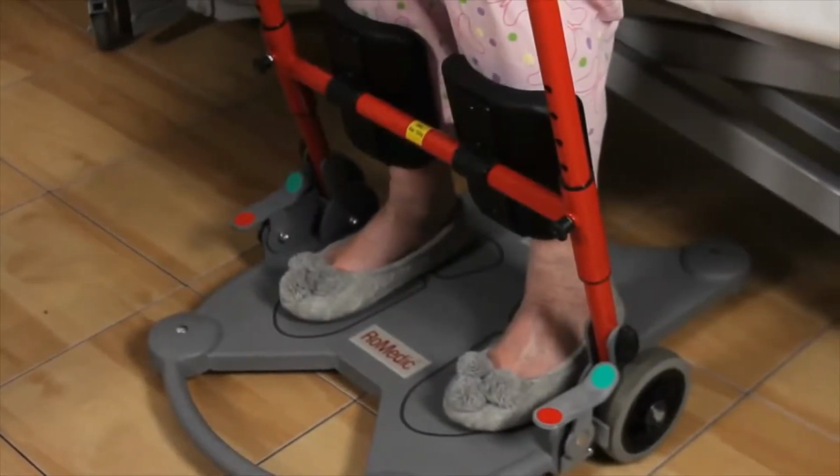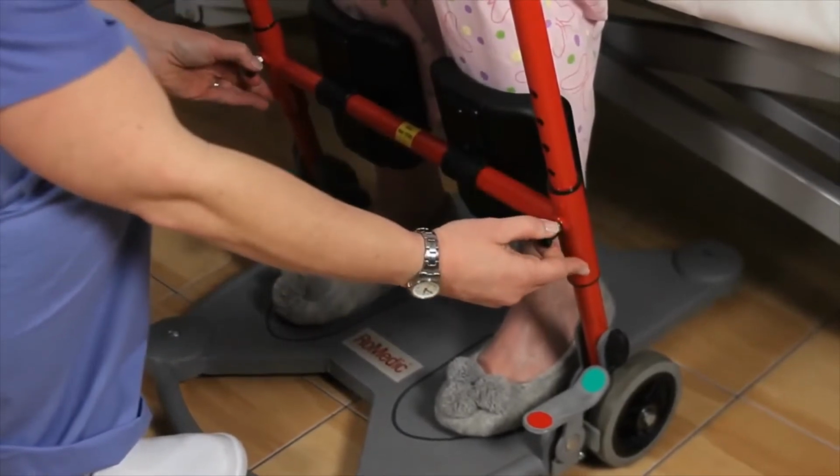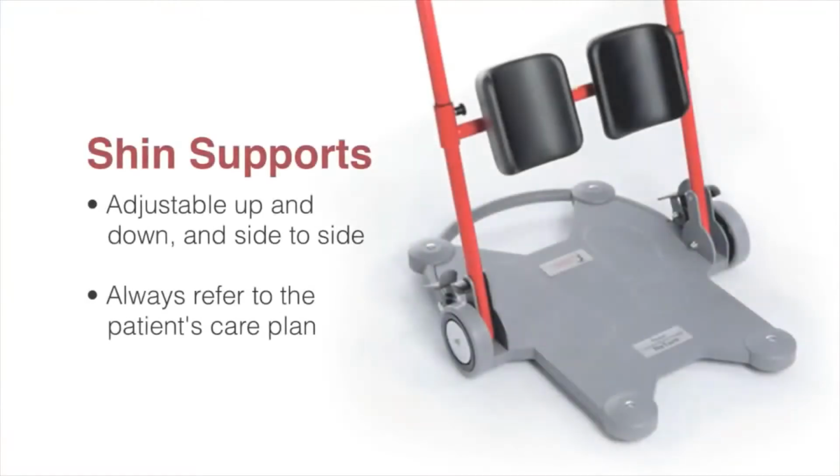The shin supports can easily be adjusted up and down by pulling the knobs and adjusting the shin supports. Generally, the shin supports should be positioned just below the patient's kneecaps. When necessary, the shin supports can also be adjusted side to side to narrow or widen the space between the knees. However, please refer to the patient's care plan as they may need to be adjusted lower in some cases.